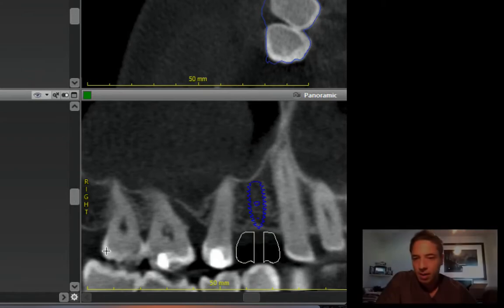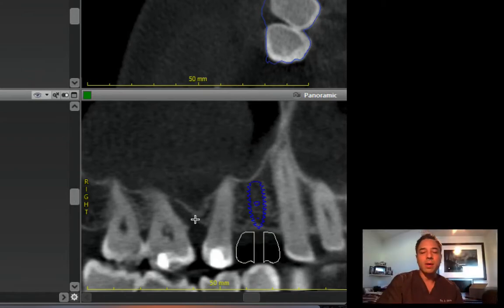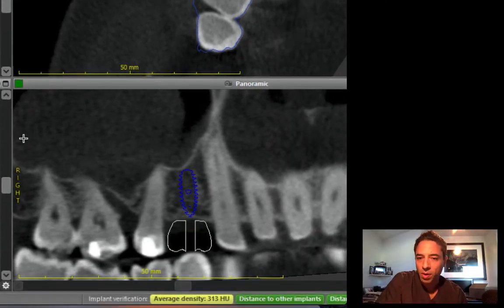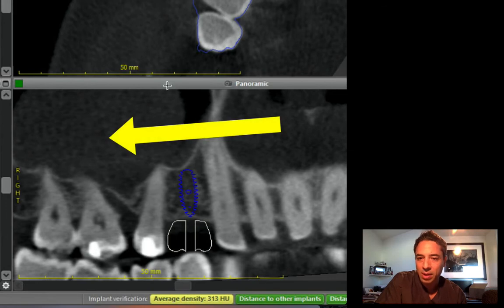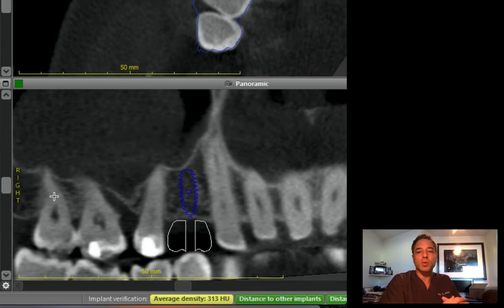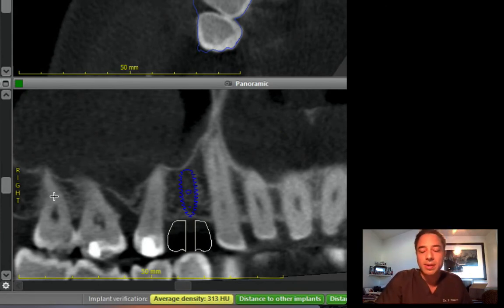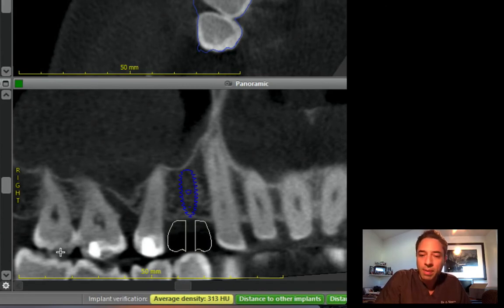Now, make sure that you look at the sinus pathology in the right sinus. There's something that looks like a large mucocele. I would definitely refer to an ENT for an opinion. It's probably coming from the molar position.